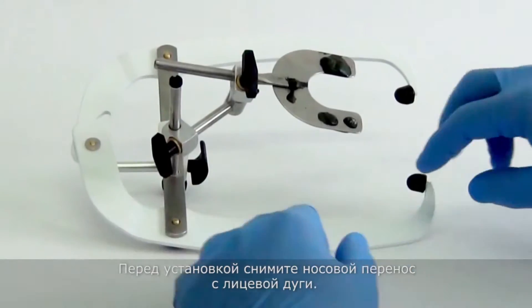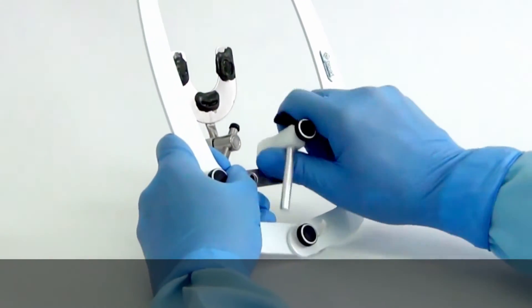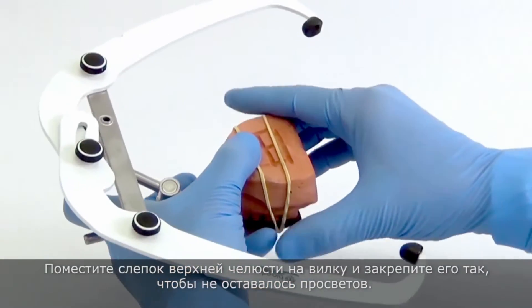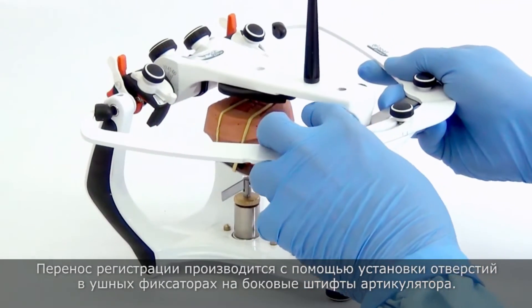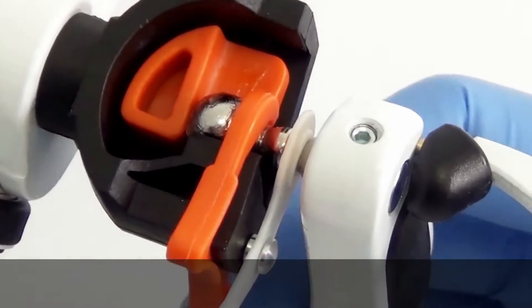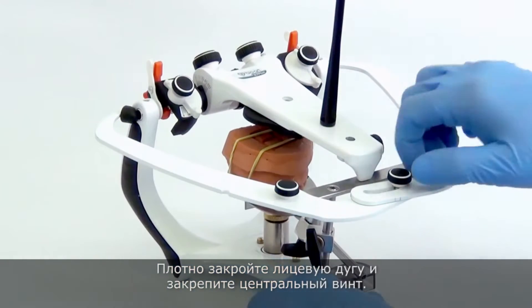Mounting of the Upper Cast. Before starting the mounting, remove the nasion relator from the facebow. Place the upper cast in the fork and fasten it so there is no clearance. The registration transfer is made by positioning the holes of the earpieces of the facebow in the fixation pins of the articulator. Close the facebow firmly and tighten its central screw.